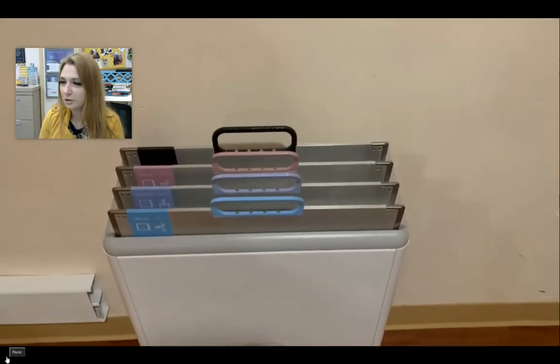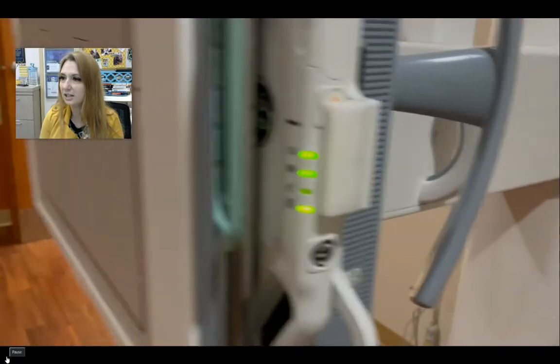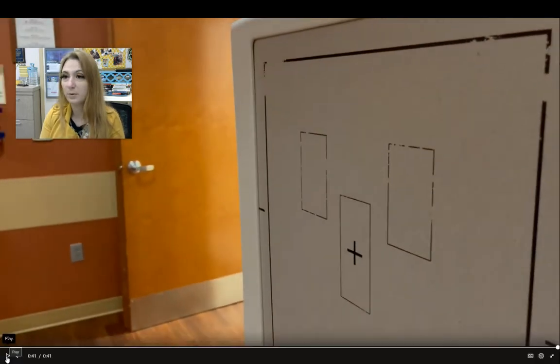We do have other interchangeable grids there, and you often see those for our UHTH site. We do keep that green grid in with our GE rooms, and it looks like this, and that's that 40 to 72 inch grid, and it just pulls in and out. Why does that remove, you might wonder? Because we can remove that, tilt the wall stand down so that it is parallel with the floor, and then we can use that image receptor for extremity work like hands.